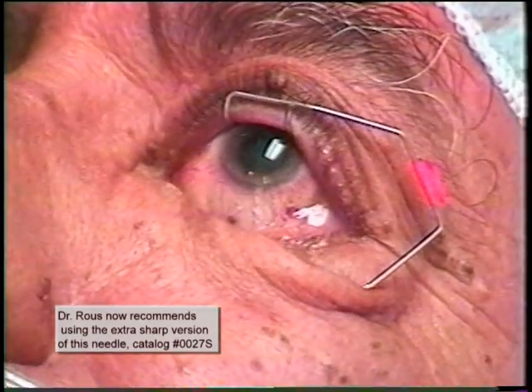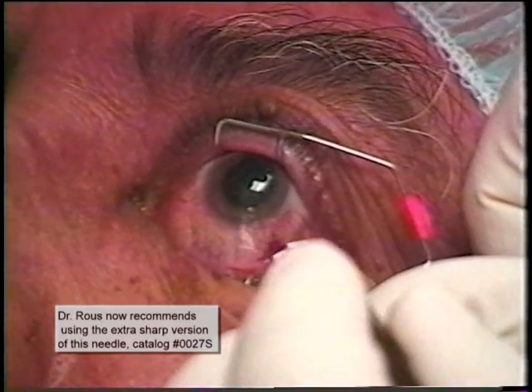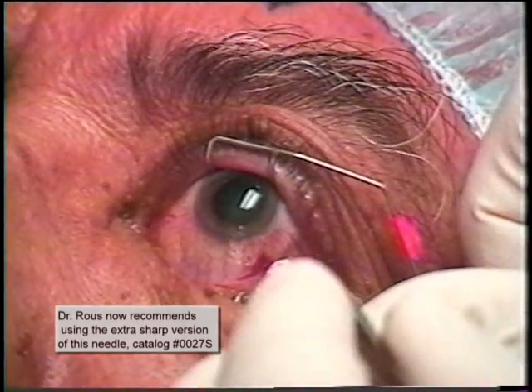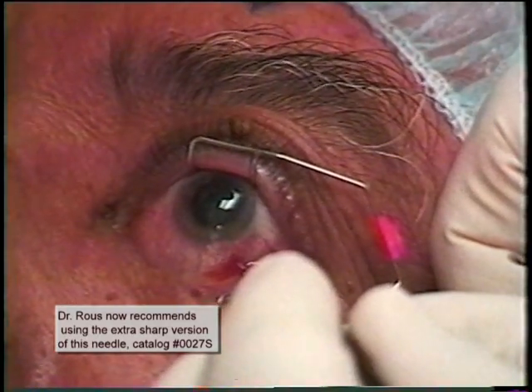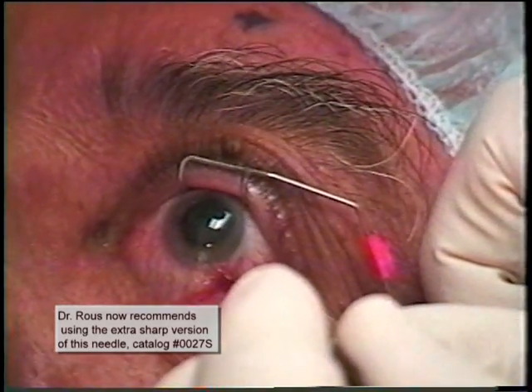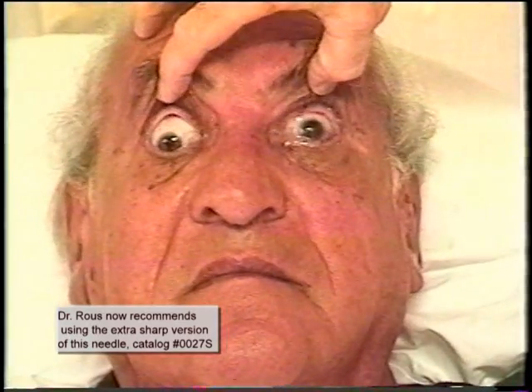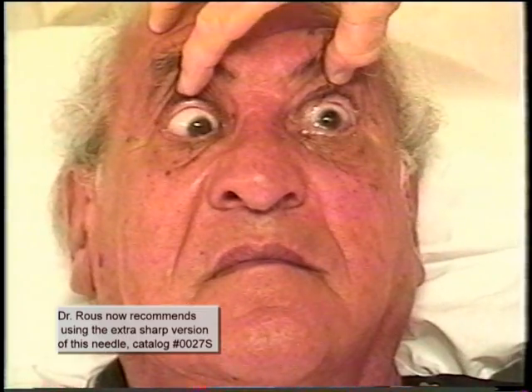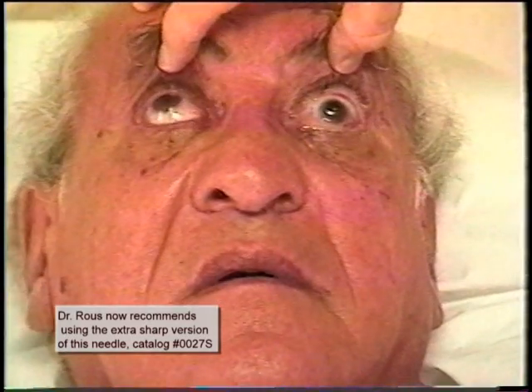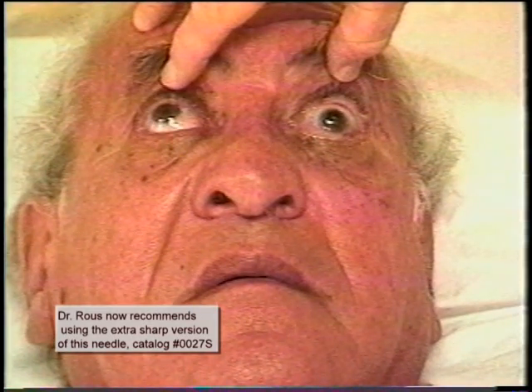This last case is just to demonstrate control of conjunctival bleeding if it should occur. A wet-field cautery is always kept at the bedside in the holding area, but surprisingly is rarely needed as conjunctival bleeding is very infrequent. But when bleeding does occur, I will apply cautery to stop the bleeding and to keep these eyes looking white on post-op day number one. As seen after removal of the Honan's balloon, the conjunctival bleeding has been completely controlled.